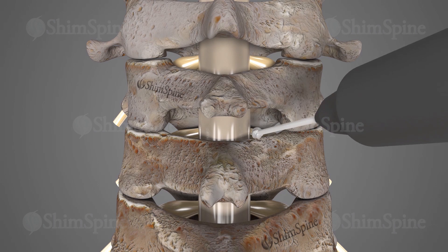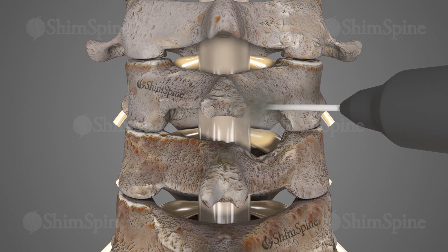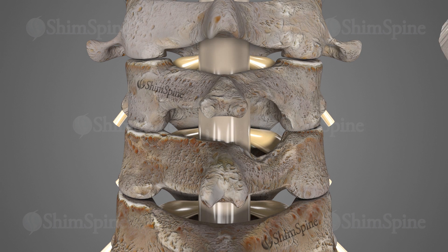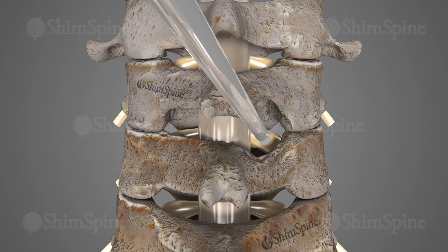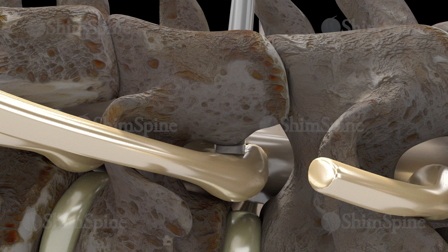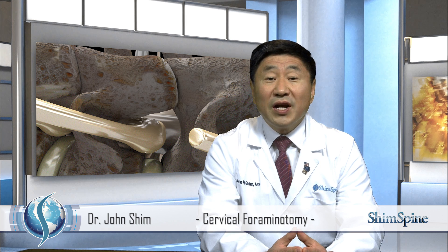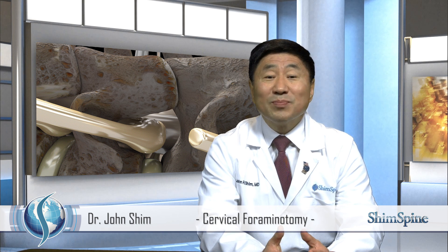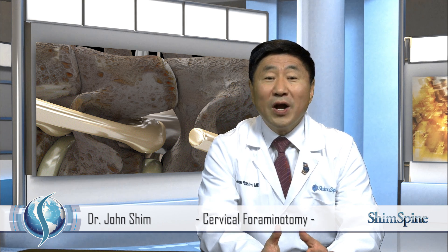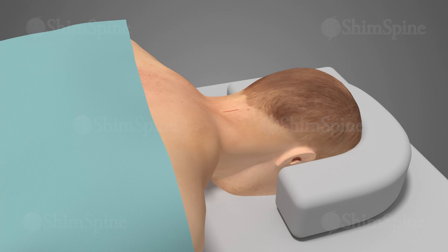Tools such as burrs, curettes and rongeurs, and micro curettes are used to remove the bony covering. The narrowing is opened. The foramen is then opened to remove pressure off the nerve. Bone spurs are shaved and, if needed, disc material is gently removed and taken away from the nerve and spinal cord. The wounds are then closed.